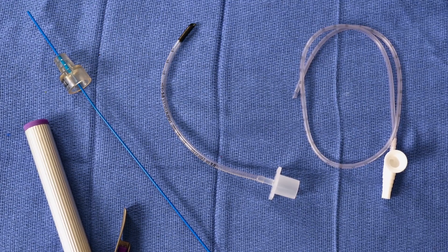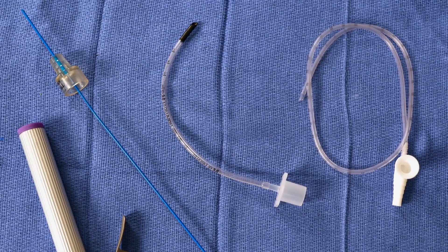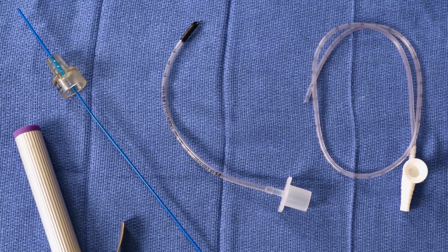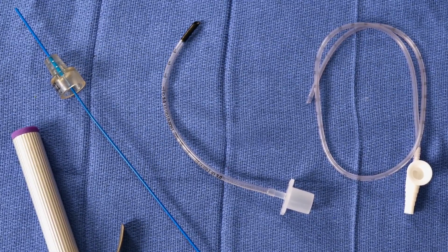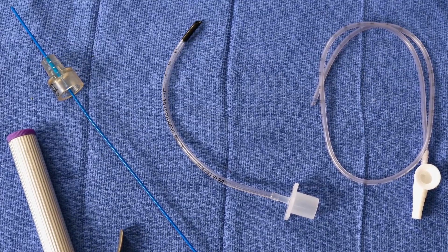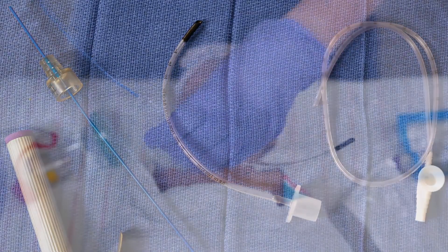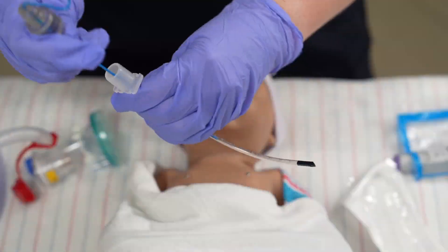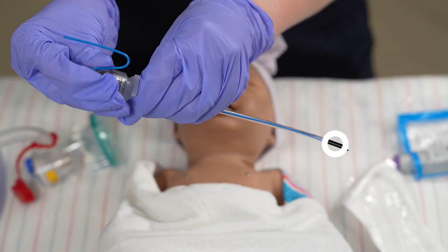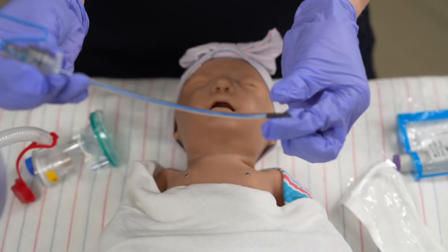Select the correct size endotracheal tube, also referred to as an ET tube. The size is determined by the infant's weight or gestational age. When using a stylet, ensure the tip does not protrude through the end of the tube to avoid tissue trauma.